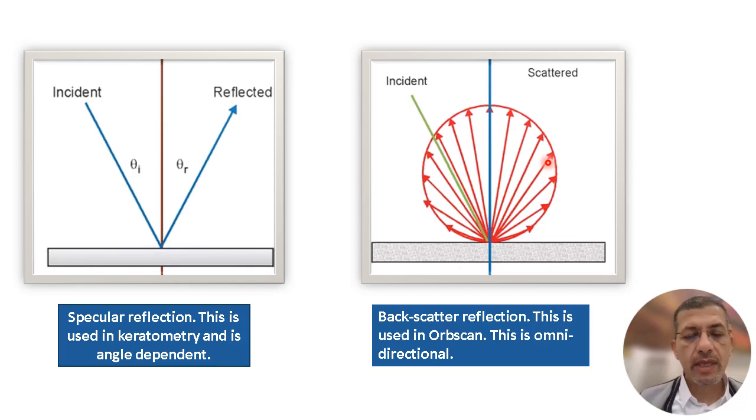And also, the scanning slit will detect the backscattered rays from both the anterior and posterior surface of the cornea. Hence, it has more information about the posterior surface of the cornea, and in turn, it will give information about the thickness of the cornea. Combining these two mechanisms together will yield very good detailed information, usually by throwing 20 scanning slits from each side, from temporal to the central part of the cornea.